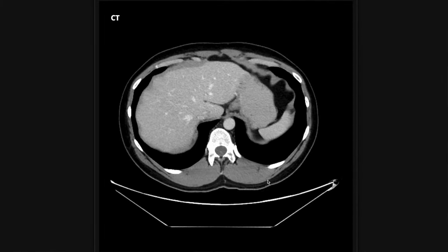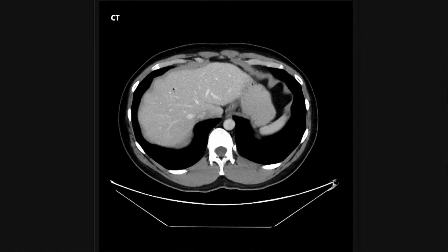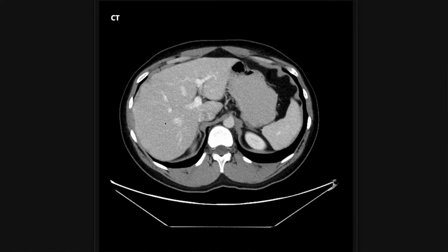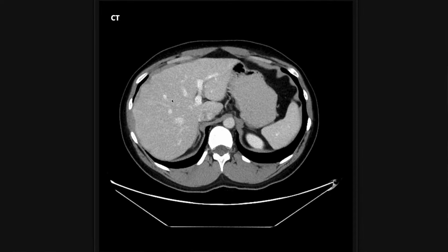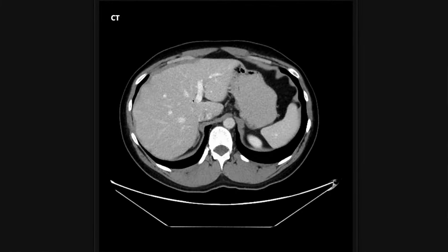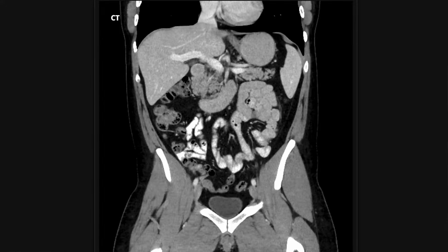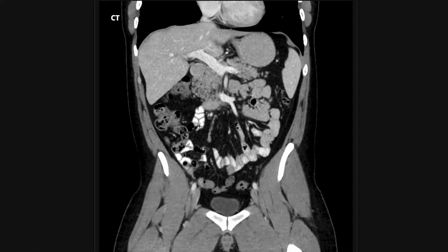Moving inferiorly to the abdomen and pelvis, I start with the liver. I pay attention to the contour — a nodular liver contour is suggestive of cirrhosis. I also look at the density of the liver; in hepatic steatosis the liver is darker than it should be, closer to that of fat, which suggests fatty liver. I then look at the portal vein, making sure there's no clot, and track the branching portal vein within the liver.